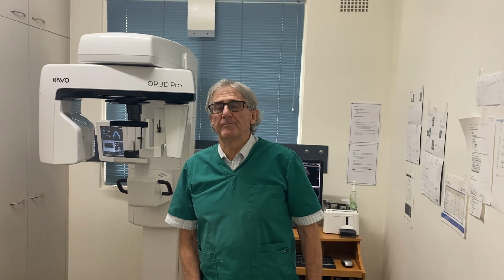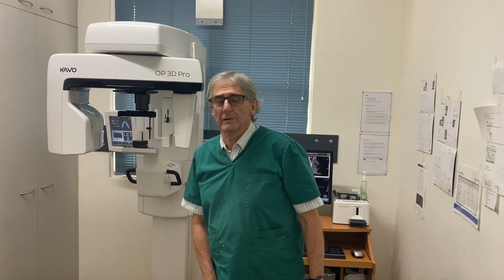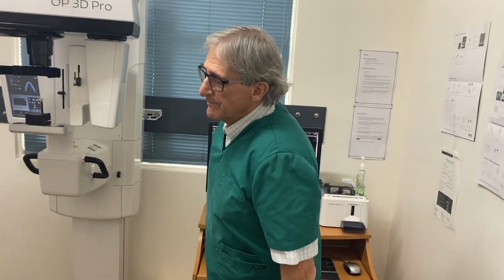A patient was referred to us because she'd had an attempted extraction of a difficult 4/8, and the operator only had an OPG, and the operator was concerned about the proximity to the nerve. She was happy with us to take a 3D image, and then we're going to proceed to get this tooth out for this lady. So if you come over here, Sean, it's pretty interesting, this case.